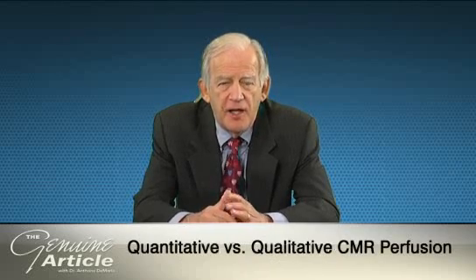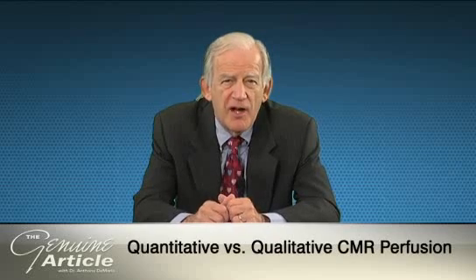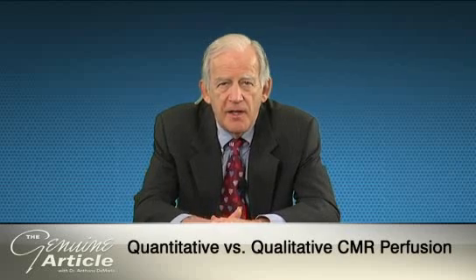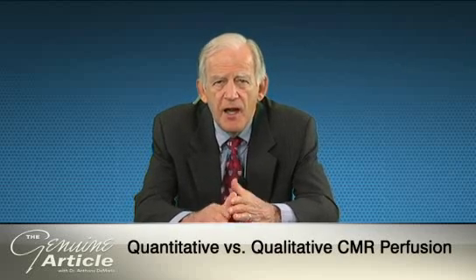Yeah, now I think it's fair to say, Chris, that magnetic resonance stress testing has not been widely adopted throughout the country. Your protocol would involve 2 injections of gadolinium and some more complex imaging. How do you see magnetic resonance stress testing, particularly for perfusion, emerging as time goes by?